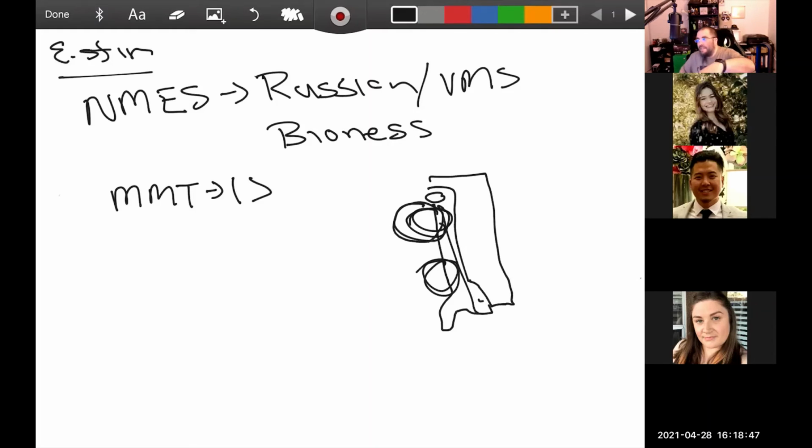Same thing with the wrist. If I start seeing a little bit of radial deviation, I'm not concerned. If I only see radial deviation, I'm concerned. If I see no extension, then I've got to move my pads. And we definitely, as PTAs, can relocate the pads.